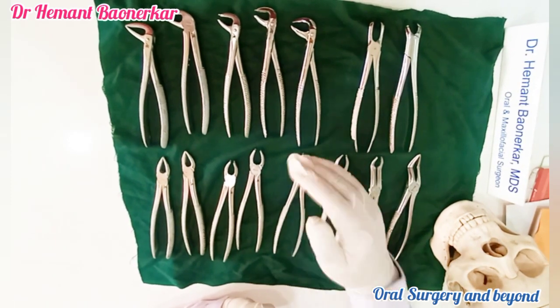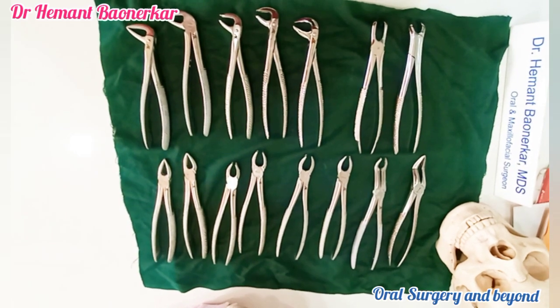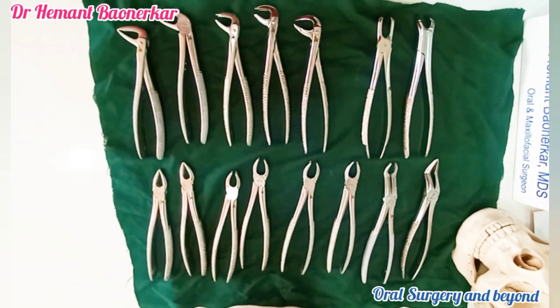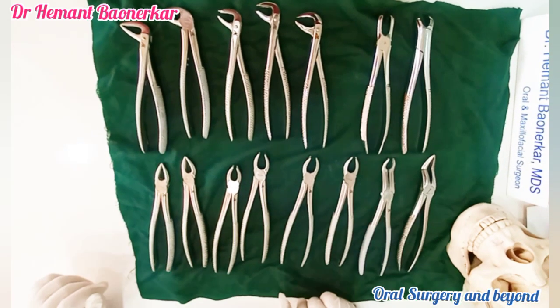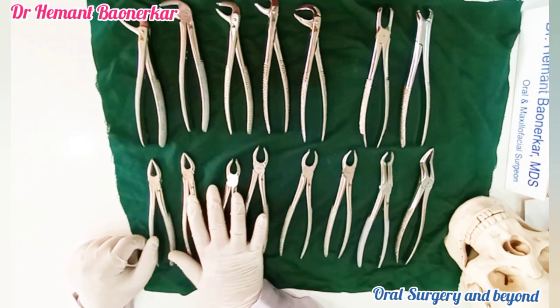Basically, this mistake is done by newer students or just intern students. For practitioners who have done practice more than five years, they do not have this kind of problem. So let us start with what are the extraction forceps.